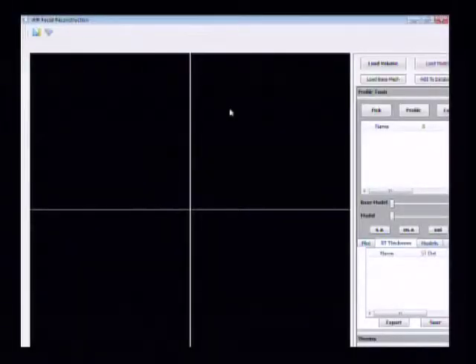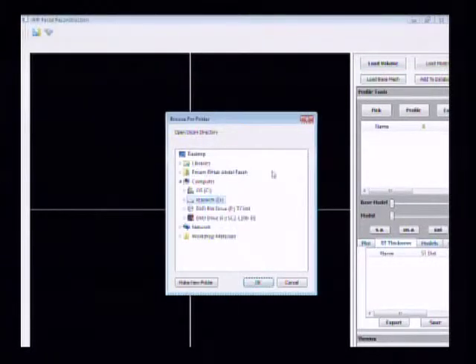What you see here is a pretty standard screen, like what you saw in Amira. You have three screens and each screen corresponds to a different plane: the axial, sagittal, and coronal, and the bottom one is a 3D volume view. The first step we're going to do is click load volume, and then it will ask you to browse for your folder. On your desktop, go to workshop material, M64, DICOMs, just click on the DICOMs folder and hit OK.